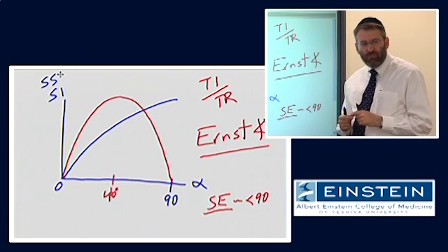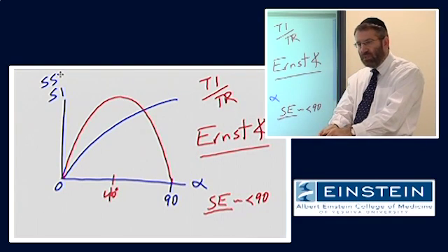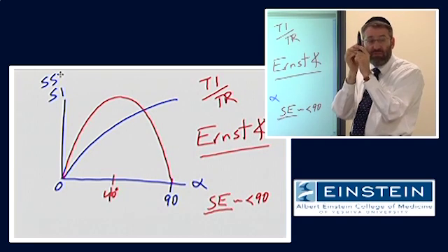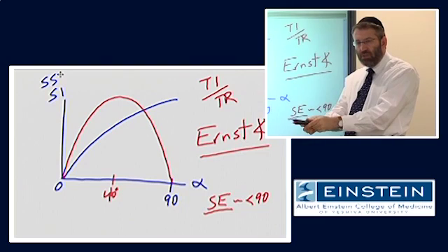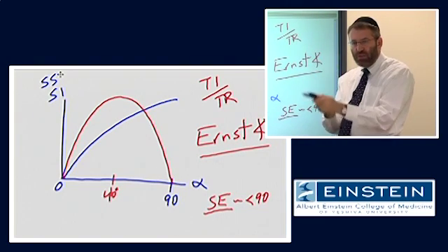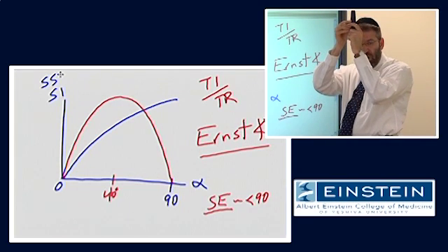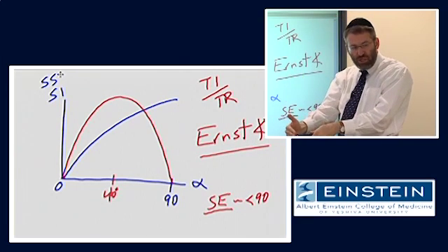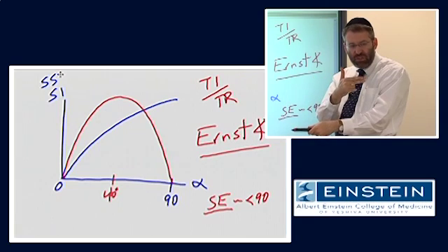Vaguely familiar, maybe? Okay. When we give our 90-degree RF pulse, if we have two tissues, and they have the same proton density, just to make things simple, we generate some signal. If our TR is really long, even though they have a different T1, they recover their longitudinal magnetization at different rates. If we wait long enough, well, they look the same. Therefore, when we generate the signal, they look the same. There is no contrast that's a function of T1.